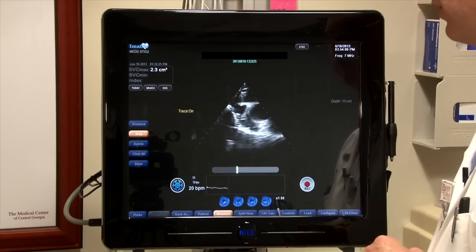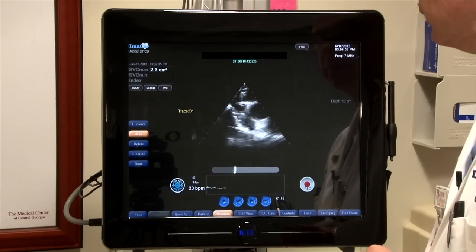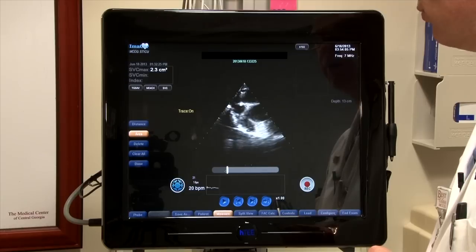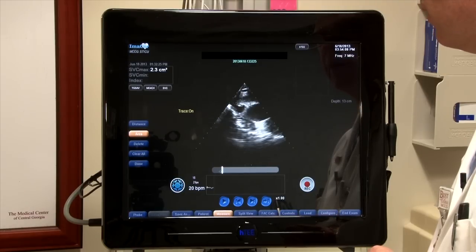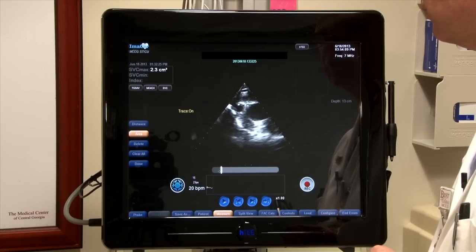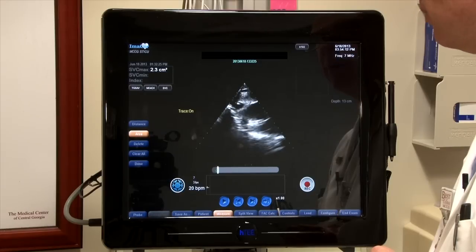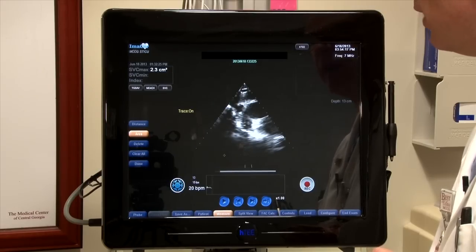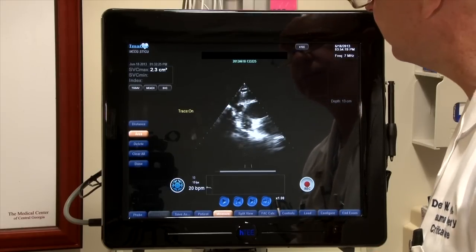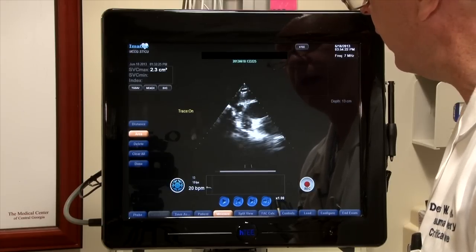Now I'm ready to look for the minimum diameter. As I scroll through here, that's about just about the best representative image there. And again, I'll outline that.